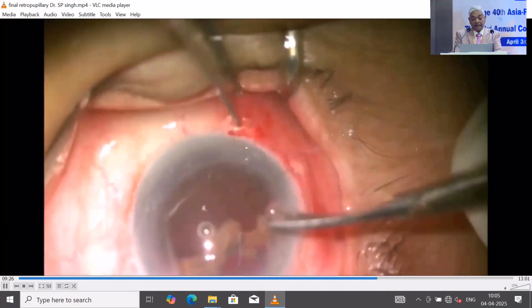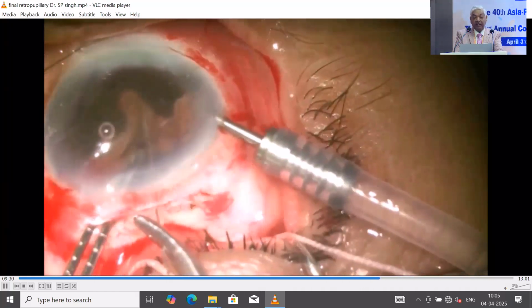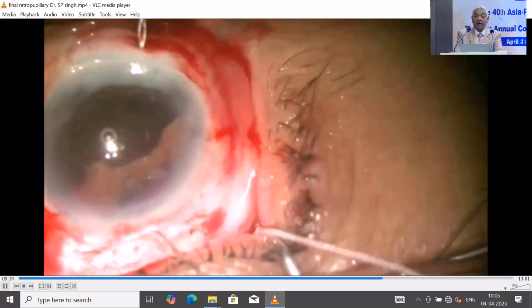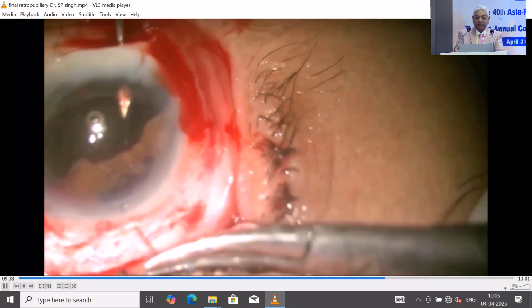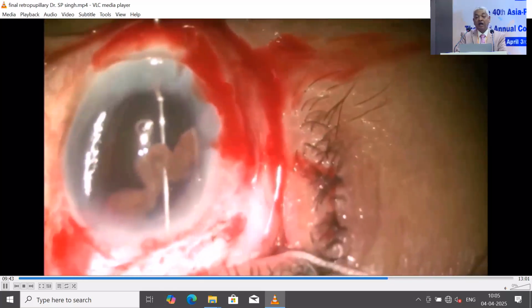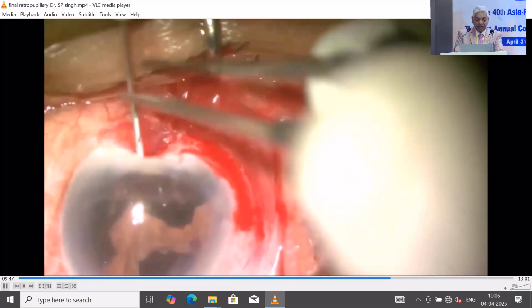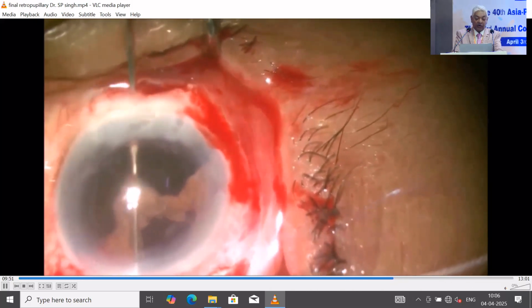After making an incision and injecting the viscoelastic solution, I observed lastly that this is not only a remnant, but severe iridodialysis. This case of severe iridodialysis happens during extraction of the nucleus by some of the trainees. It is a referred case from another center, and you can see how small the attachment is, only a very small area, and how difficult this case is.